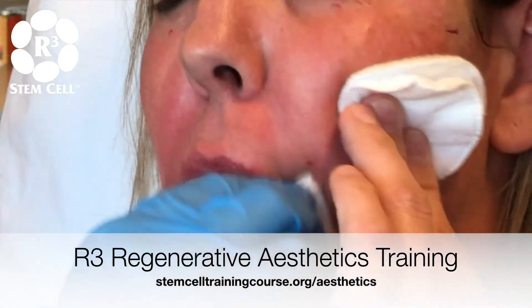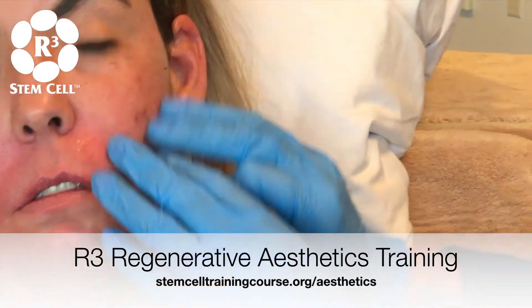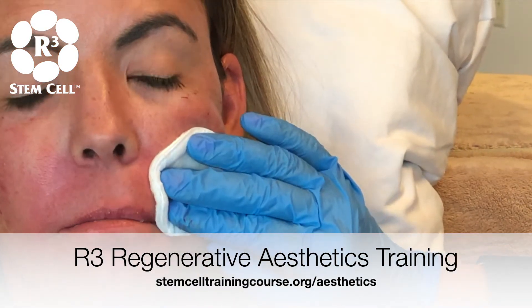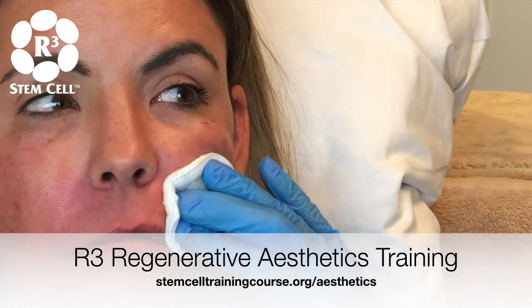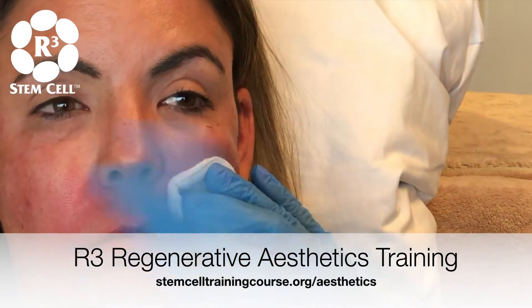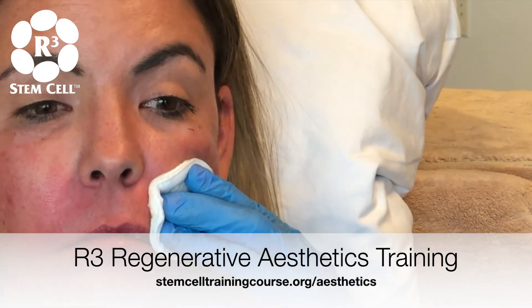Really it's more like five minutes. Tori had all that scarring — she's got more acne scarring in this area. So it's a little bit more tender and she will have a little bit of swelling. But by morning most of this will be gone. She may have a bruise here or there — I don't see any, but there's always a possibility of a bruise with any stick.